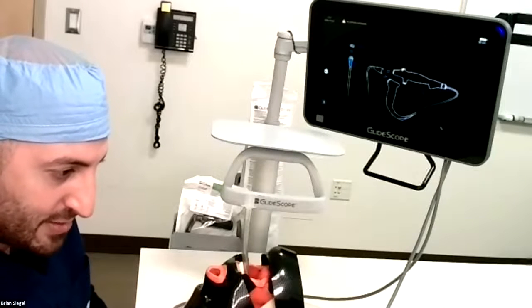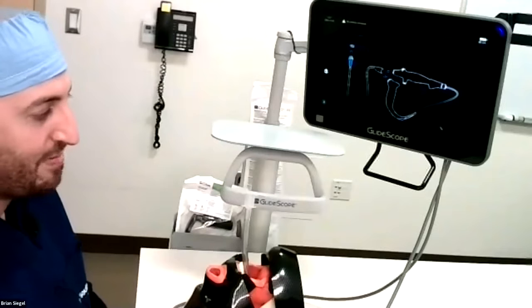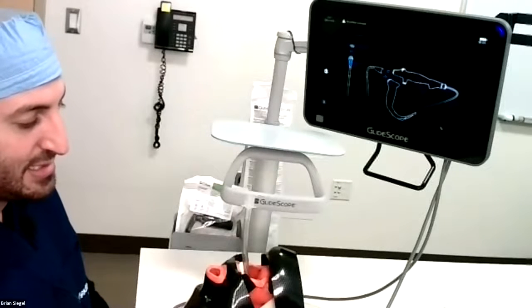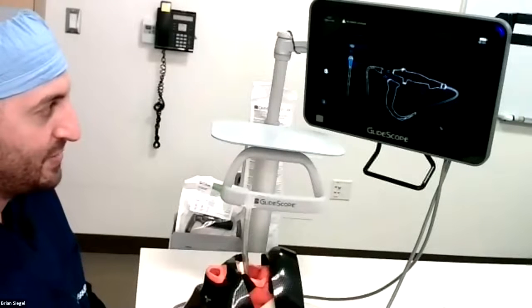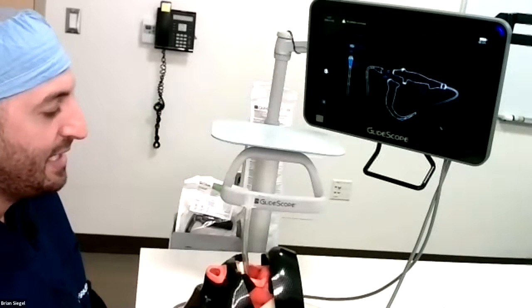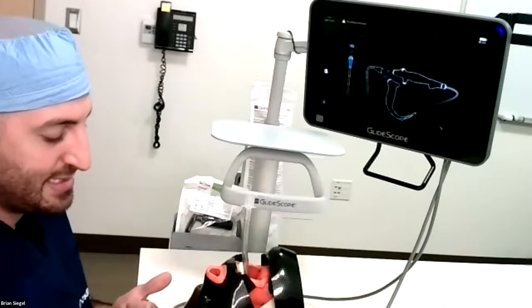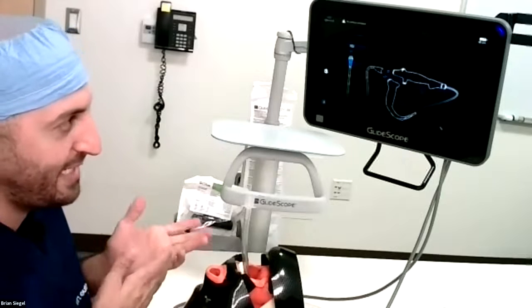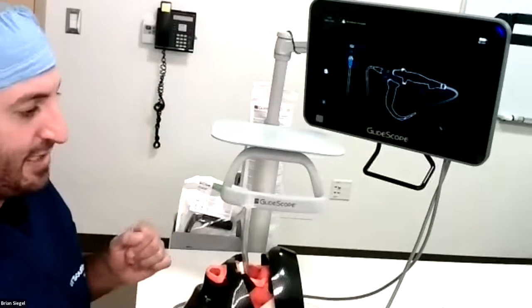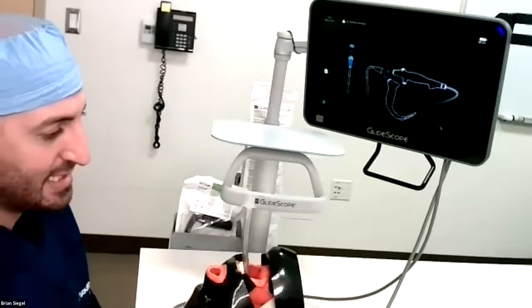Question: is it easier to use a small flexible endoscope for an anterior larynx with GlideScope than a disposable scope? I like the disposable scope because it's so quick, easy, and readily available. There's also a 3.8 B flex — that's the smallest scope I want to use, because anything smaller becomes too much like a wet noodle. On the GlideScope core in our OR, we have the GlideScope handle as well as the B flex disposable scopes hanging right on the tower. As you can see, the B flex is right here in the back and here are my handles. If I have a view with my handle and quickly need the B flex, I can have anybody pull it out of the package, connect it, and have it ready in 10 seconds — that's why I like it.